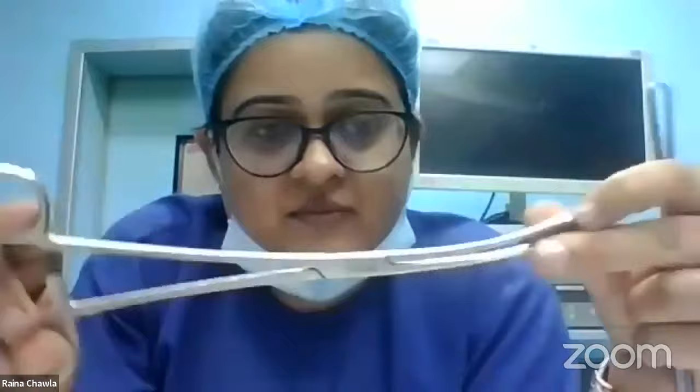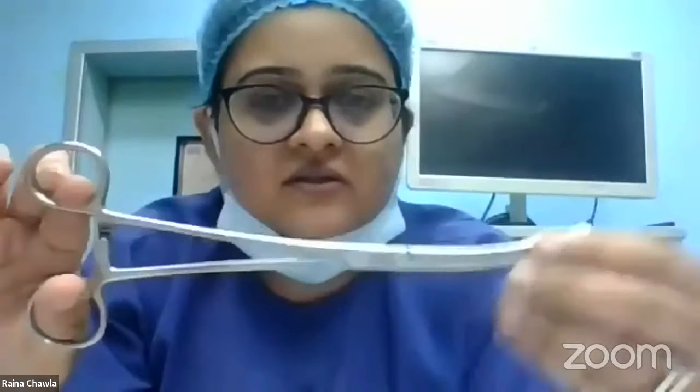So these two instruments, can you see this? This is a vulsellum. It's a long instrument. It has a slight curve in the middle. And if you look carefully at the ends, can you see those? Those are the teeth. I'll put it across my hand. So you can see these are the teeth. So it's a traumatic instrument. Anything which has teeth at the end like this is traumatic. That means it can cause trauma to the tissue you're holding.